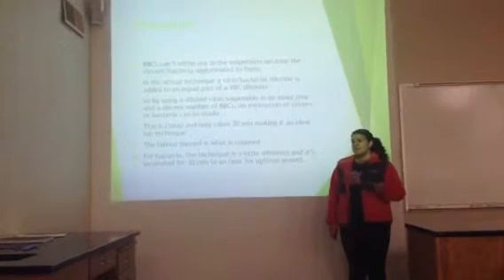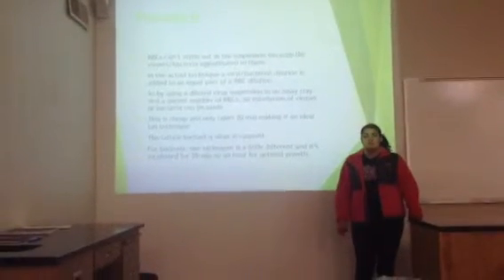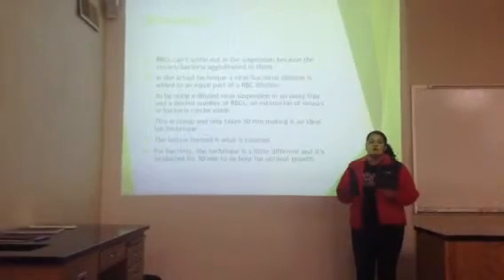But for bacteria, the technique is a little different. You would put it in an incubator for 30 minutes to an hour for optimal growth of the bacteria, to see if there are bacteria present.